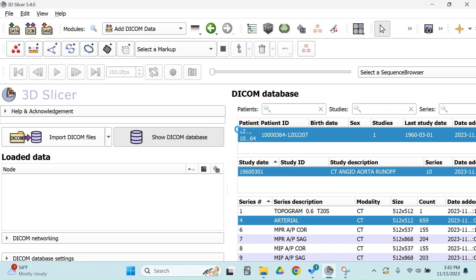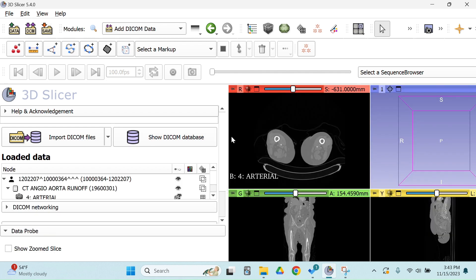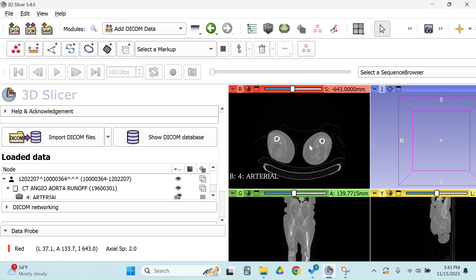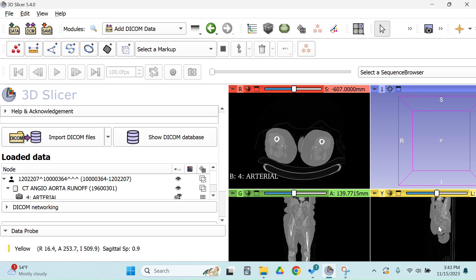Just double clicking. And so what am I going to look for? I want to make sure I have all the body parts I need in this. So I have both the bilateral femurs I can see as I scroll through. And we have the coronal, the sagittal, and the transverse views, which is great, because that's exactly what I need for the modeling.